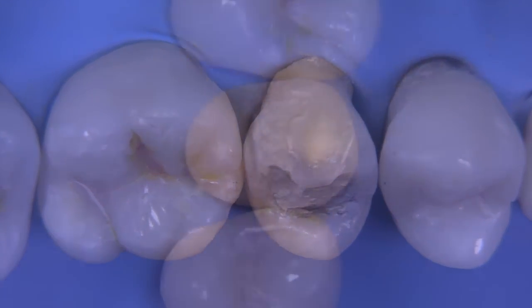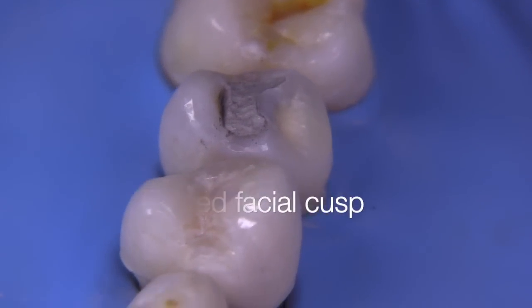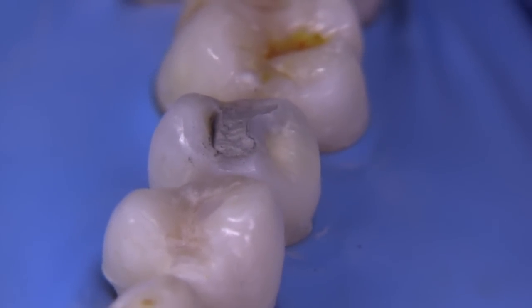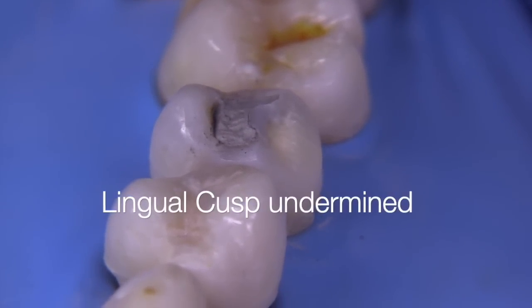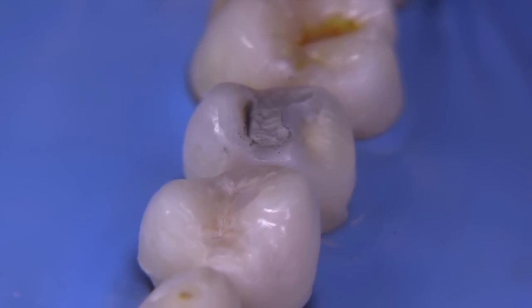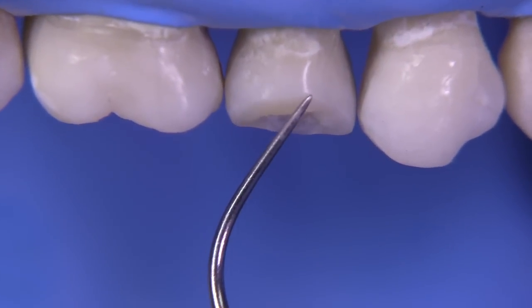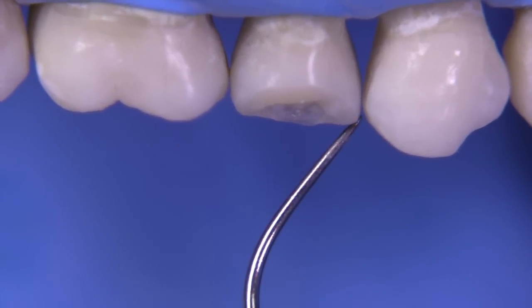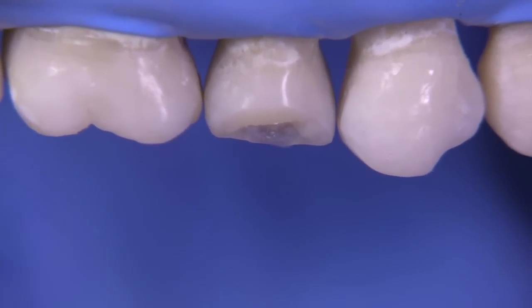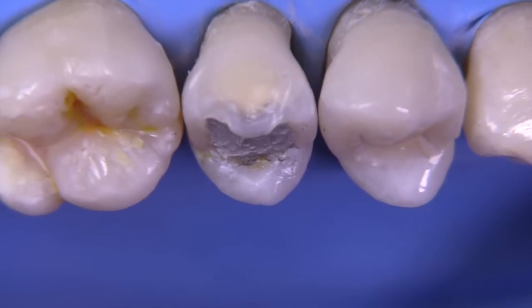Before we start the restoration, let's think about why that facial cusp might have fractured. Is this parafunction? Was the patient biting down on something hard? Is there something we need to do functionally before replacing this restoration? Looking from the facial, you can see that there's a significant amount of cusp missing, and we're going to want to build all that back up, being mindful of the occlusal scheme and the guidance pathways.